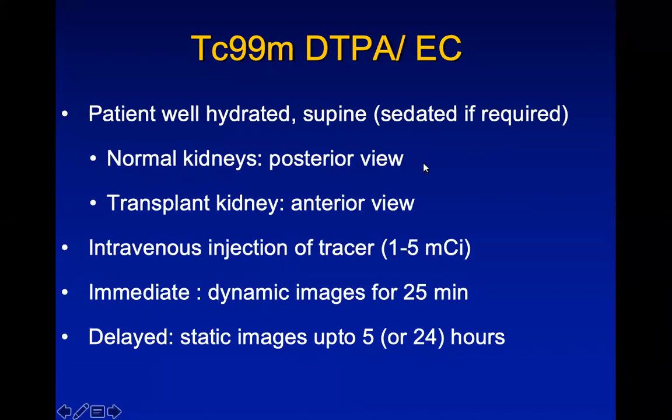So the side must be very carefully determined. In transplant kidneys, we take an anterior view because here the kidney is positioned anteriorly.